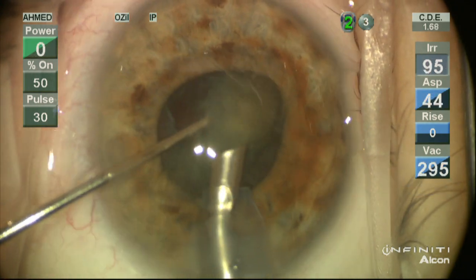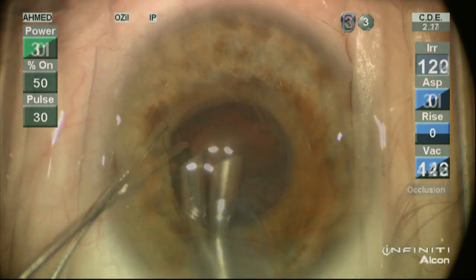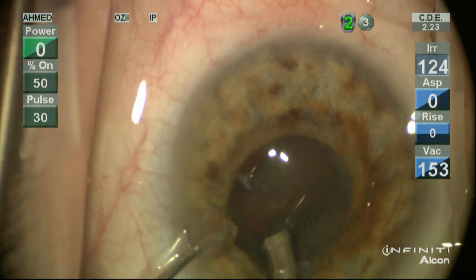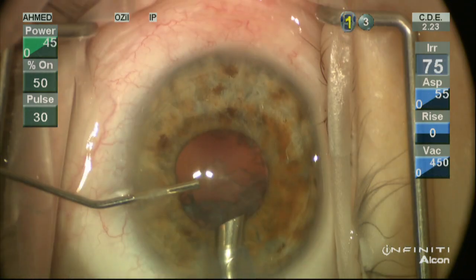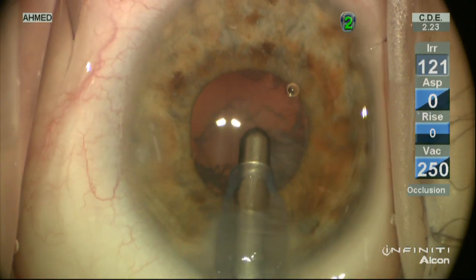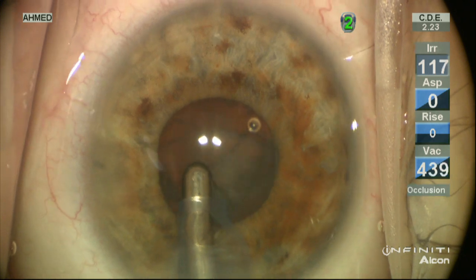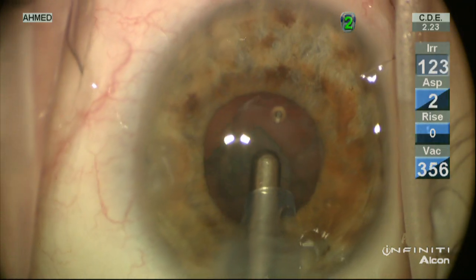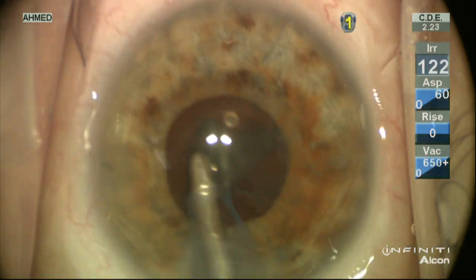The second hemi-nucleus is similarly brought up into the iris plane and removed. This is a safe place to do this, keeping us away from the posterior capsule and away from the endothelium. We'll then remove the epinuclear shell, which is often present in these mild to moderate cataracts, and this will make cortical removal easier. Prior to removing the handpiece, we inject BSS to maintain chamber depth — important to prevent any shallowing. The cortex is removed using our straight IA tip, typically removing sub-incisional cortex first, leaving the remaining cortex to act as a protective barrier and shell. This is all done through a small pupil.